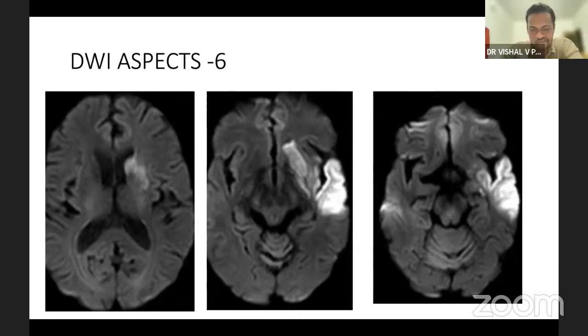There is complete occlusion. See, the complete occlusion, MRI has shown it. There is no, in CT angio. So Dr. Singh wants to say calcification. That's a very fantastic point. Calcification again tells you whether it's a chronic lesion or not. Agreed. Totally agreed. You have a carotid that is calcified.